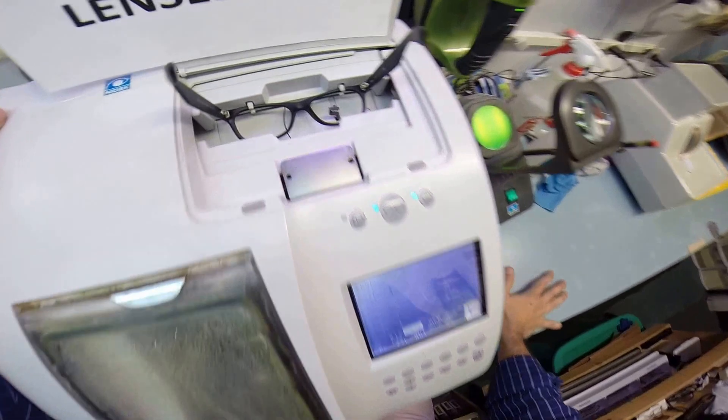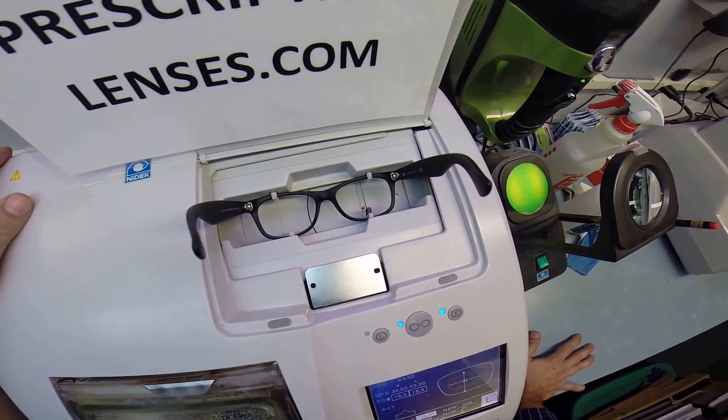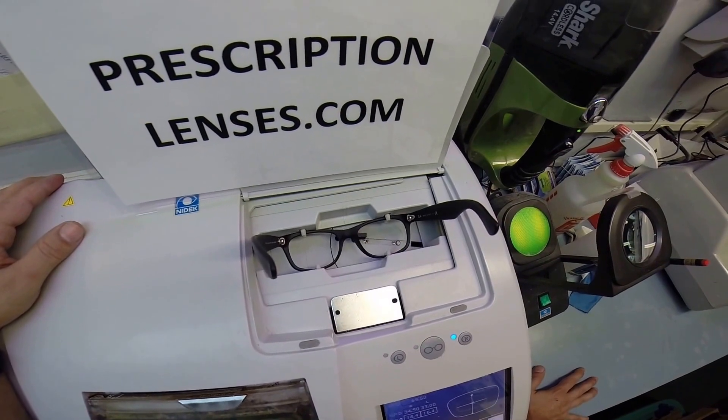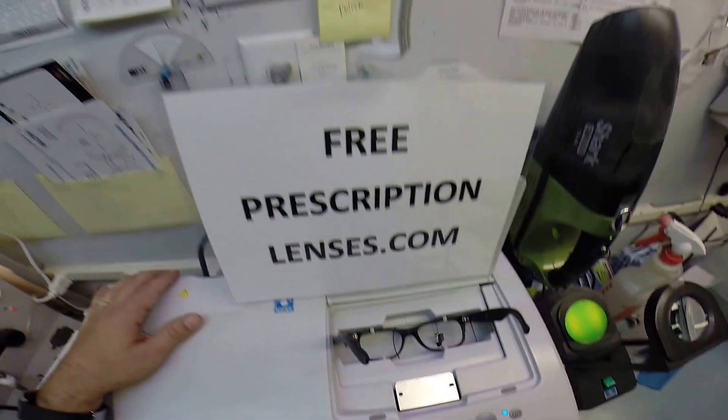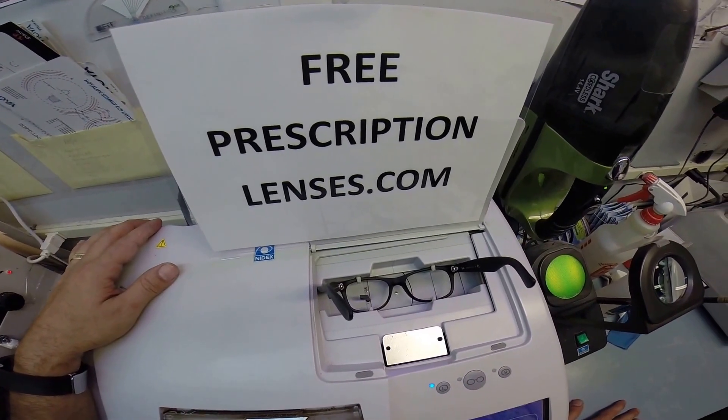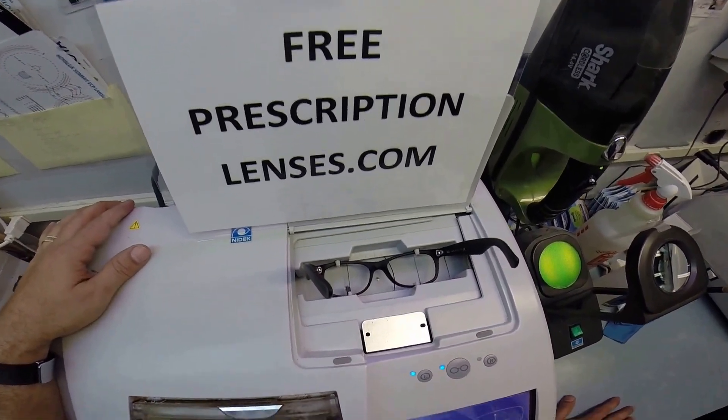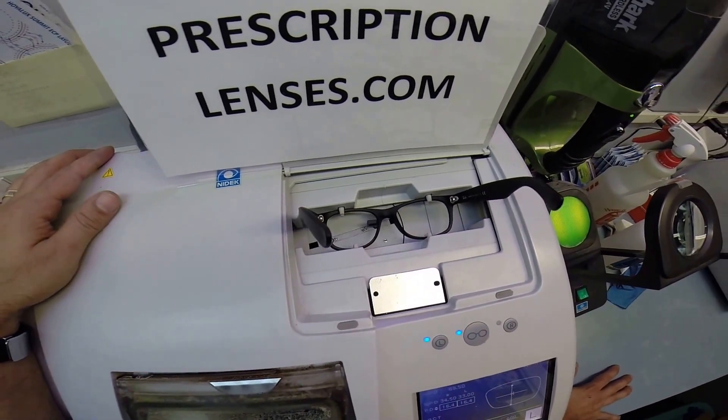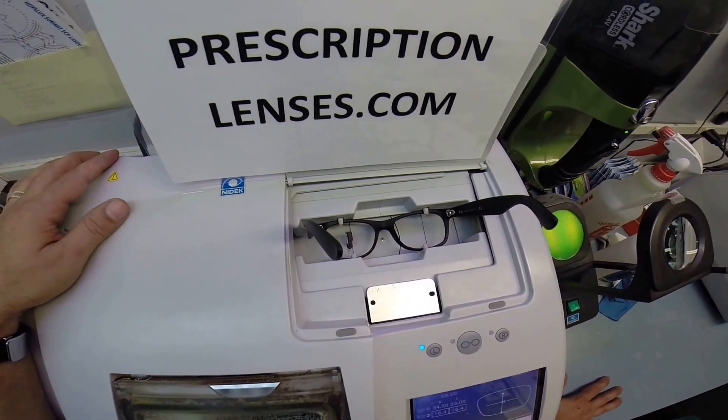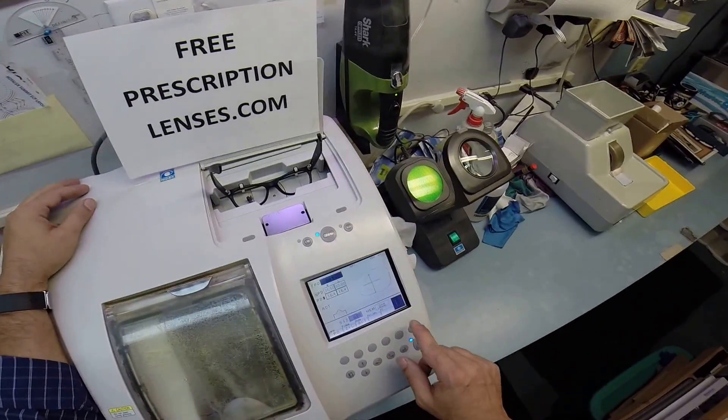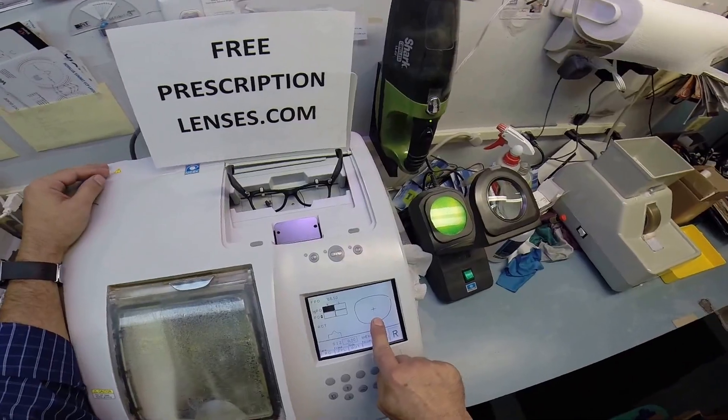The stylus is coming up and tracing the shape of the right lens, then it's going to move over and trace the shape of the left. Here at freeprescriptionlenses.com, where everyone loves a bargain and no one is disappointed with quality. You buy a genuine authentic Ray-Ban frame or any frame for that matter, and you receive free single vision prescription lenses.